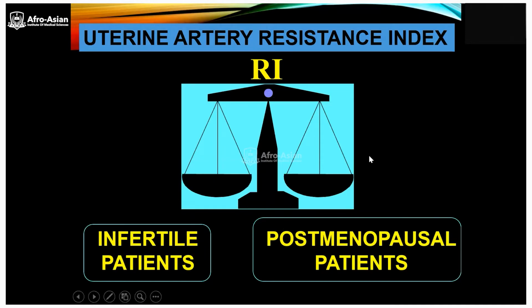The uterine artery resistive index assessment is very important, especially for infertile patients and postmenopausal patients, to rule out the cause of infertility and to assess any pathology which is related with the postmenopausal status.